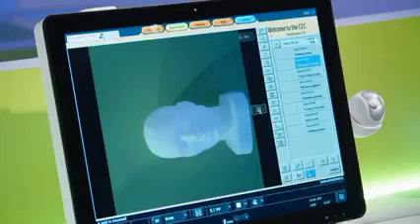So the functionality of the camera at the tube head, again, was easier positioning without bending over the patient, but the same camera will give you as a user a way to check just prior to releasing the exposure if the patient is still in the center. And if you are also using the C90 in a training environment, you can guide your students in a better way without moving with them and looking over the shoulder. No, you can do this from here, from the control room, giving more confidence to the patient as well as to the student itself.